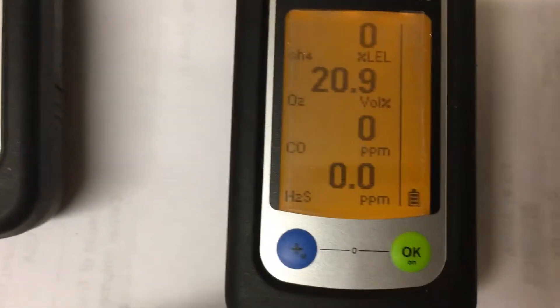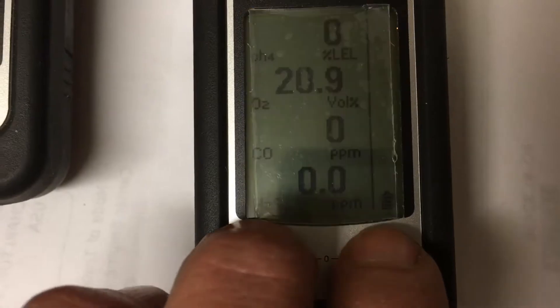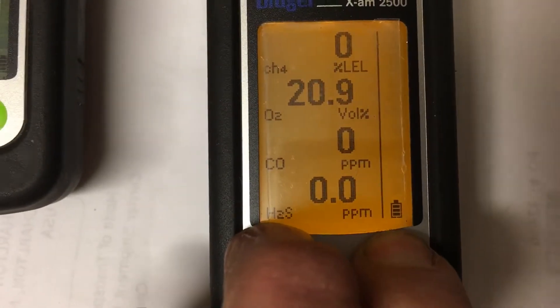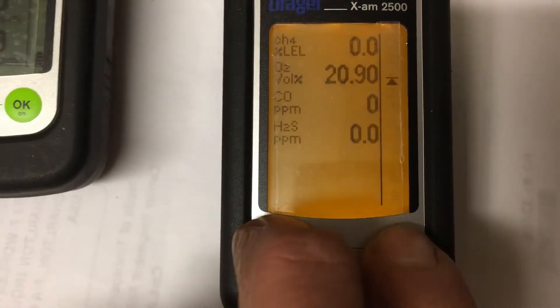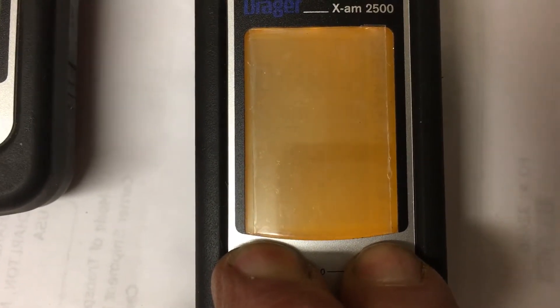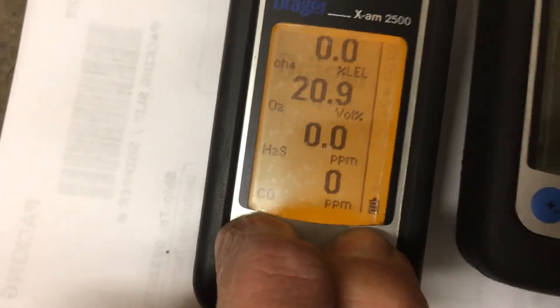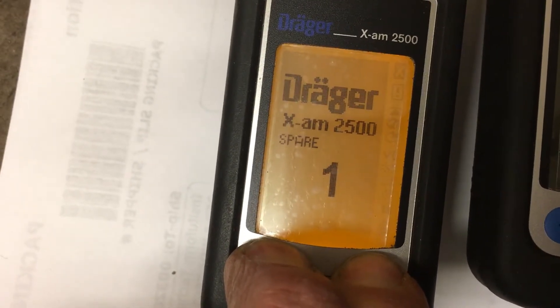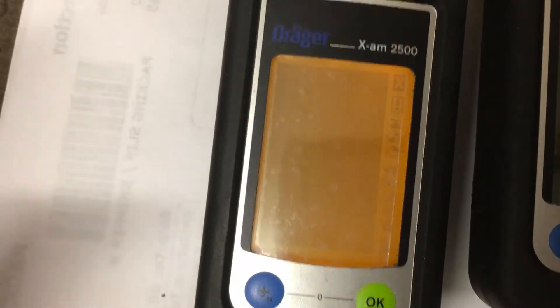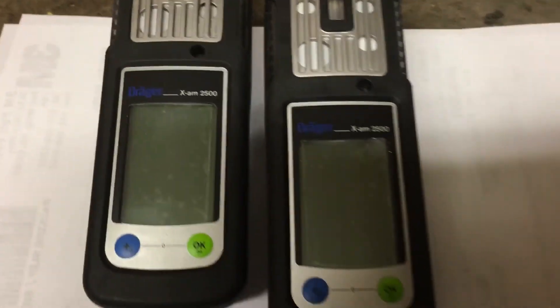When you're ready to shut it down, hold the blue and green buttons down together at the same time. It does a countdown, makes a noise, then just let go and it's turned off. That's it — nothing hard about it.